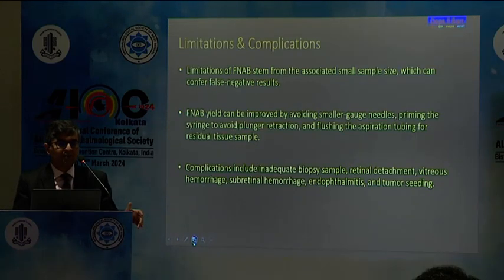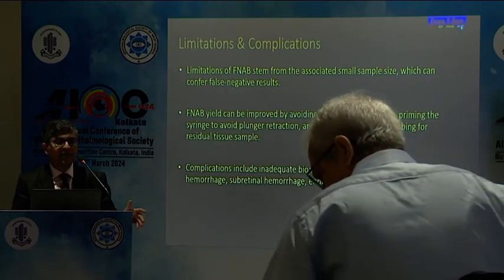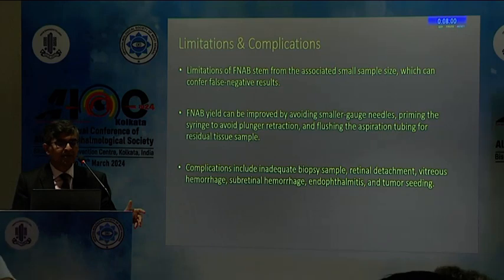So last, I will just say, yes, there are some complications related to biopsy. We all need to be sure that this is the only attempt you have got to take the biopsy. So make sure that all your instruments and all your pathologists are informed well in advance. Complications related to biopsy, yes, sometimes you do come across vitreous hemorrhage, retinal detachment, but they can be easily managed as we do for any other retinal complications. So I will conclude.